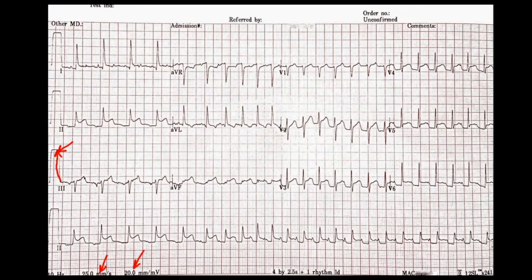The first thing we want to do is look at the rate. Just by looking at this EKG, you can tell right off the bat that the spaces between the QRS complexes at the beginning are different than at the end, so there may be a rhythm change. Any time there's this kind of irregularity, remember that this is a 10-second strip, and there are six 10-second periods in a minute.